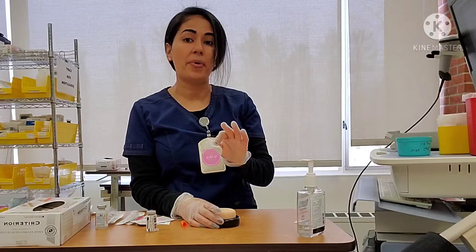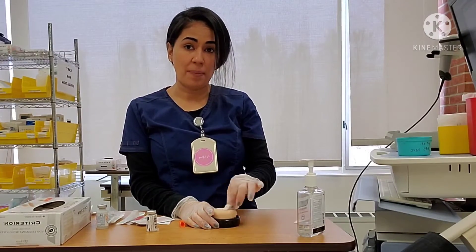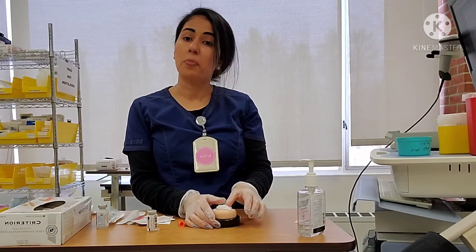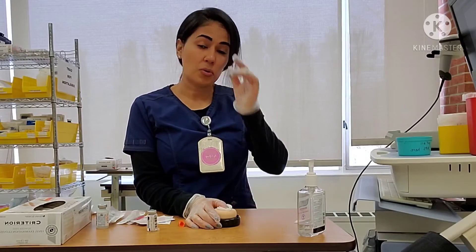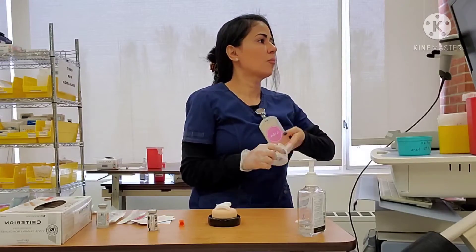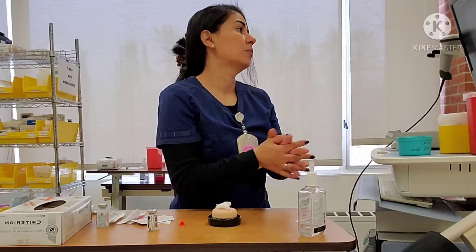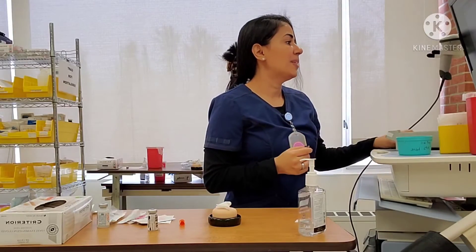The big thing to remember is that you're never going to rub. I'm never going to rub insulin. All I'm going to do is apply firm pressure if needed — if there's any blood, just apply firm pressure. In most cases there's no blood, so you'll be able to just leave the patient. I'm going to finish my documentation and update my chart. The next thing I want to administer is heparin.